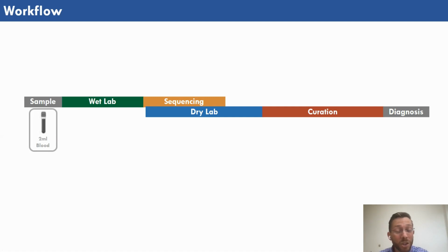And then we can send it to our genetic counselors where they can identify which of those genetic variants may be associated with this clinical presentation. From there, doctors can make a final diagnosis.